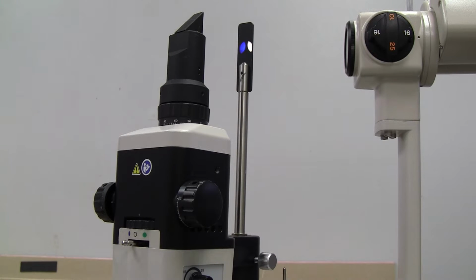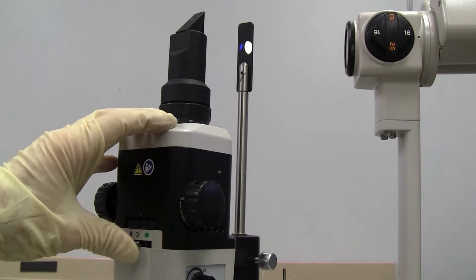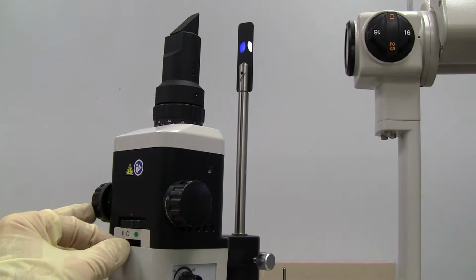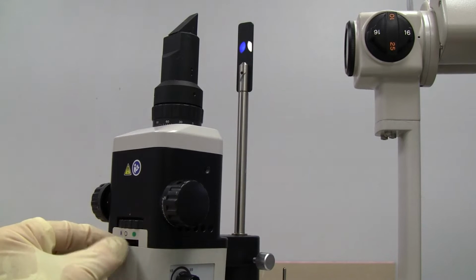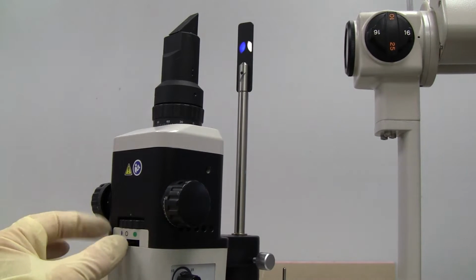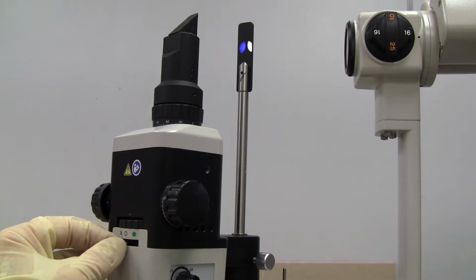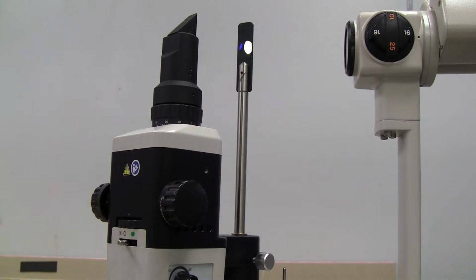Okay, we have an issue here. The lever won't turn anymore. It will not go to the blue filter, and it's stuck and it's loose. So something's going on inside here.